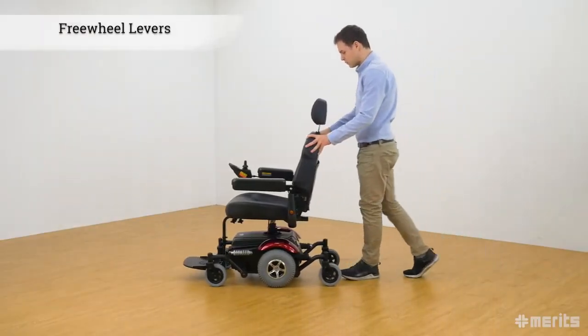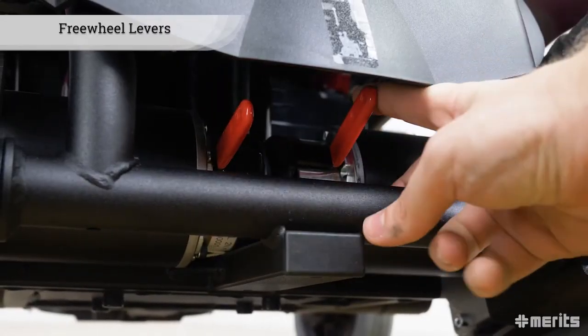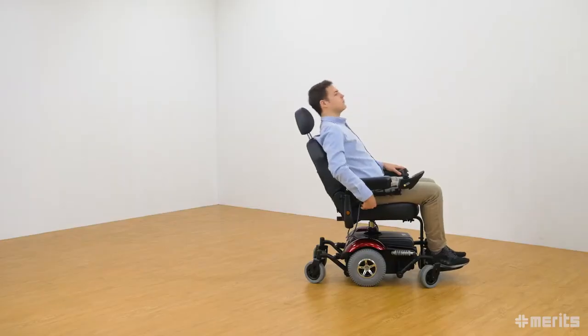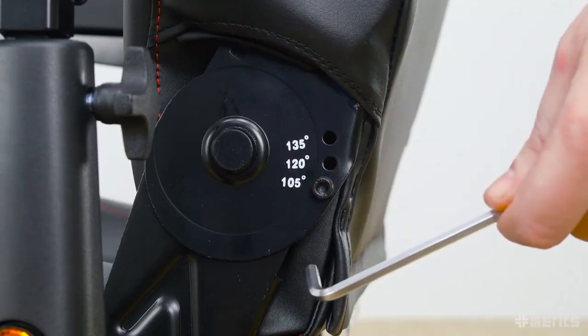The power chair can be pushed much like a standard wheelchair simply by flipping the freewheel levers at the rear of the chair. The lever on the right of the seat controls the seat inclination. Additionally, the seat back can be manually adjusted to varying degrees.